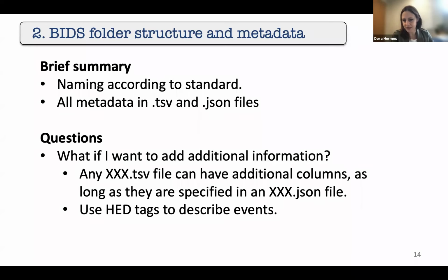And one of the examples that I would like to give for how we make that machine readable is one of the things that Tal Palatia has been working on in my lab, where we use HED, hierarchical event descriptor tags, to describe events.